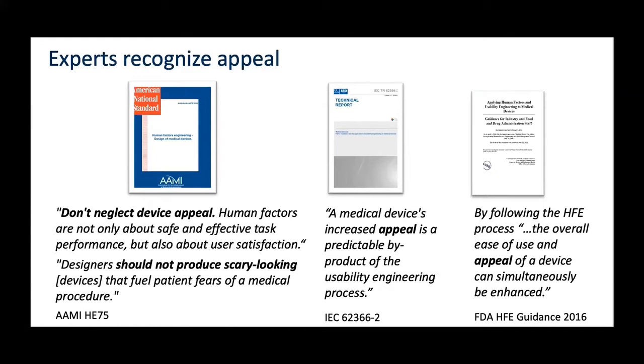And I do know that particularly when you've got a market that has incumbents in place, and they're a bit clunky and don't look so great, then often the brand appeal of the new device disrupting that is a very important part of the market disruption process, which is a key part of medical device development. It's not all about the technical side of things. So yep, I really appreciate what you're saying here.